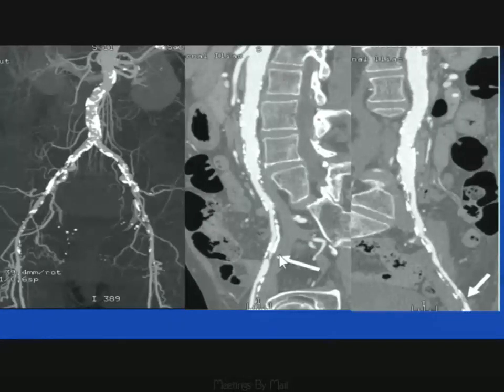And this would be done even better, I think, with, and I don't have a demonstration of this, dual energy capability of separating calcium from iodine. Now, that's rather difficult. But that would be ideal if one could have a flow lumen where you didn't have calcific plaque adjacent to the flow lumen.